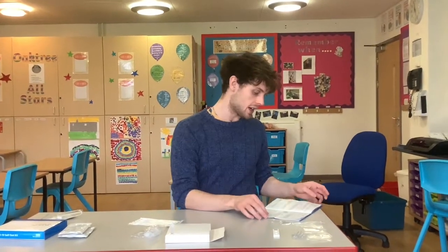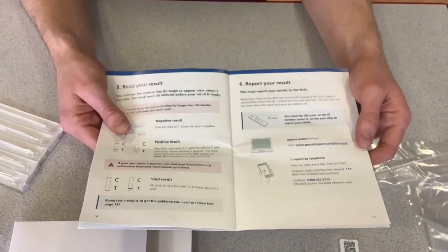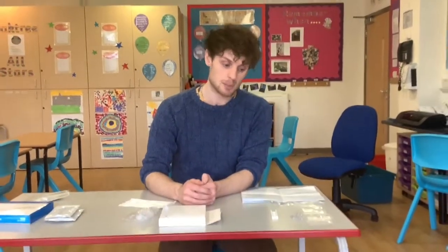There is a section in the booklet on page 15 on how to register your test. The website is www.gov.uk/report-COVID-19-result, and Trish has also taken some photos which will detail how to do this part of the process.